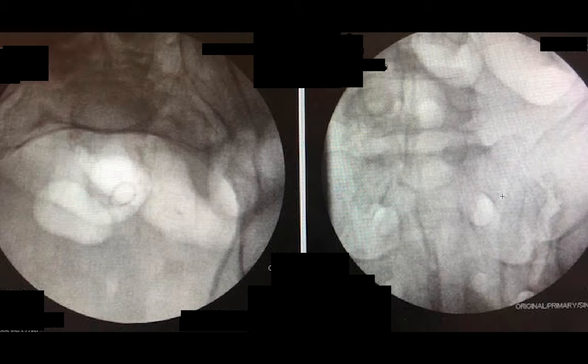But you see this pathway here, and you can see how narrow things are over here, that you have to sneak your screw across this foramen. Now, in dysmorphic sacra, the S2 corridor is typically much wider. When I measured this person's S2 corridor, it really wasn't very large at all.